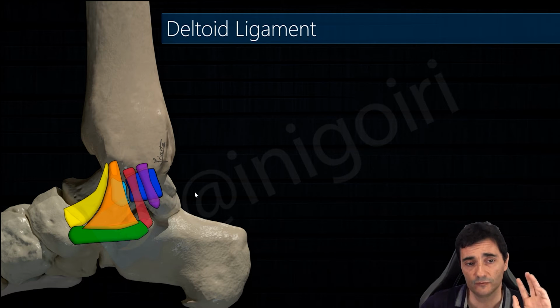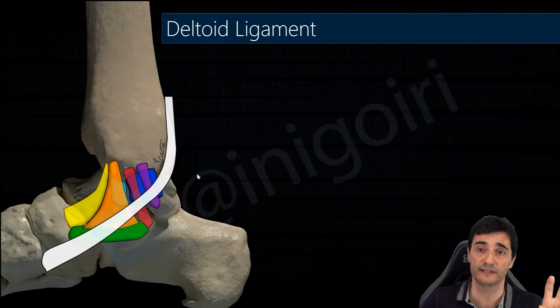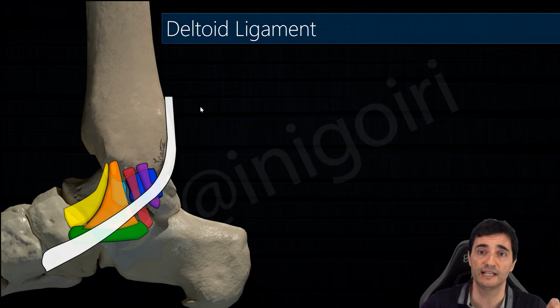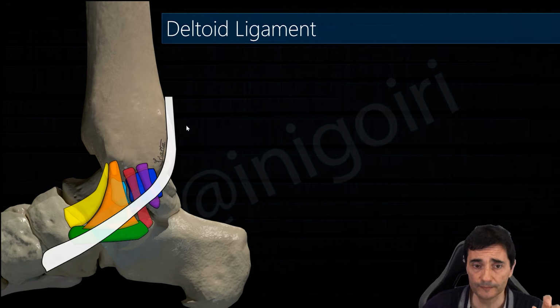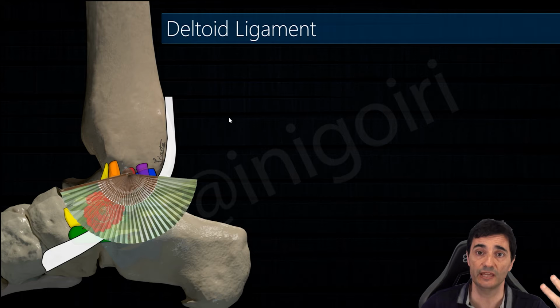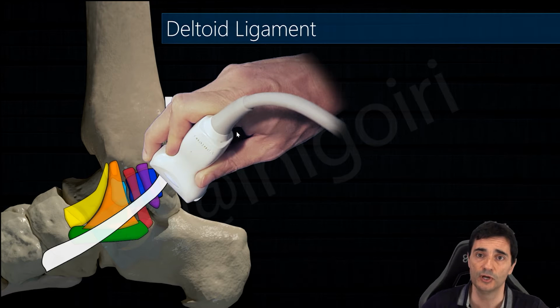Okay, and to finish, a structure very important to check all this, to locate all these areas and on its function, which is the posterior tibialis tendon, which crosses all these structures above. Remember that this has a hand fan shape, and we always need to orientate properly the probe to have a good view of these components.